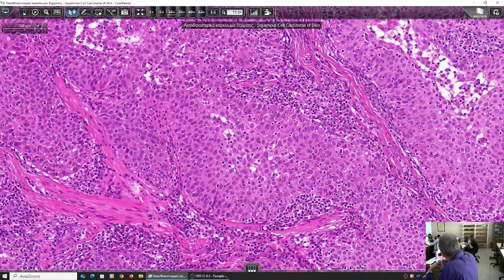However, we managed to understand that these cells are of squamous derivation. So, which grade would you apply to this squamous cell carcinoma? We managed to understand that it derives from squamous cells because we saw pink cytoplasm in the malignant cells and areas of dyskeratosis. That means keratinization of single neoplastic cells, not forming keratin pearls. So which grade do you think?